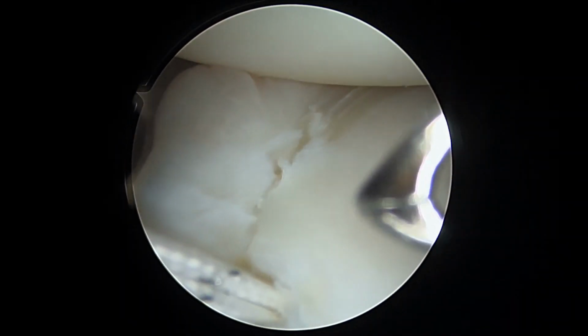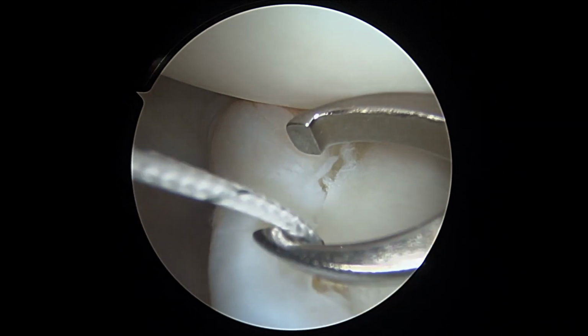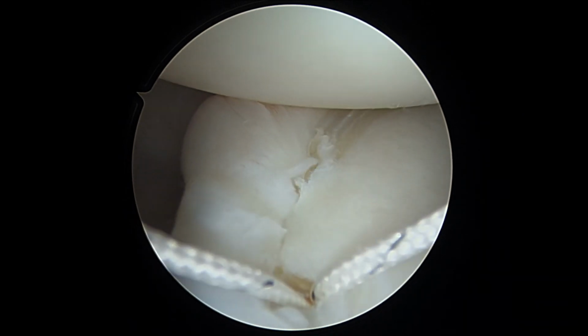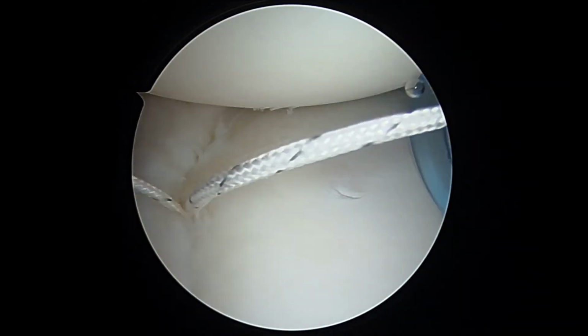Okay, we've tied the first mattress stitch in the front, and that's so tight you can't even see down there anymore, so I'm happy with that. We're about to do another stitch right here. So this is our third anchor. Sometimes you just do a simple stitch, sometimes you do a mattress. We'll decide that in a minute, but I just wanted to show you the progress that we're making here.